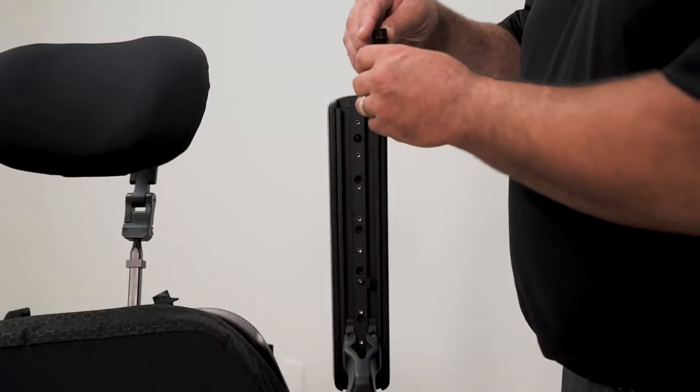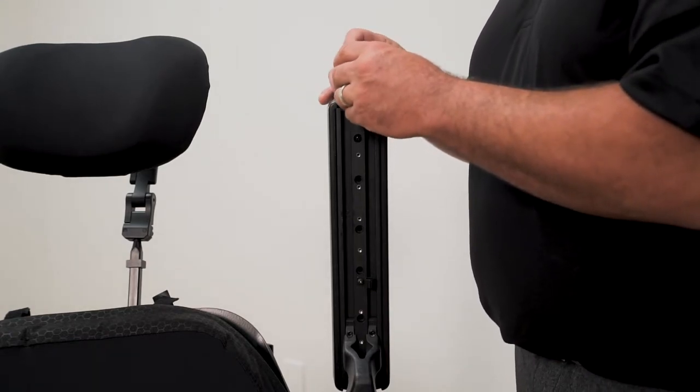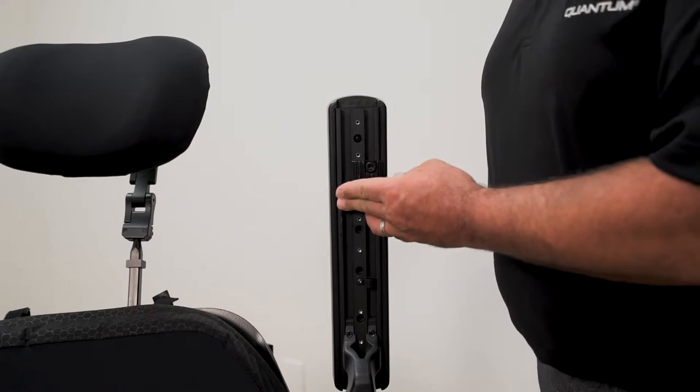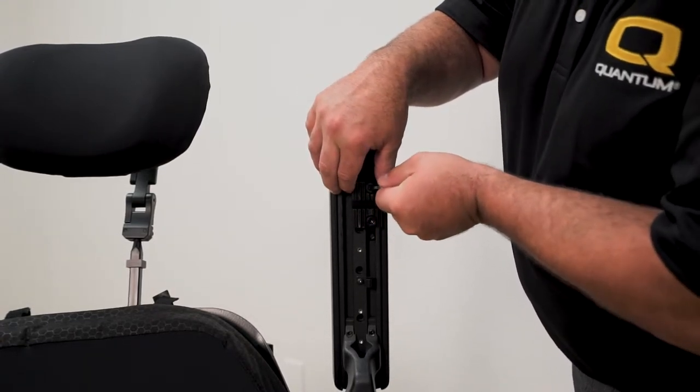To start, grab the display gooseneck clamp and slide the T-nuts into the slots underneath the armrest. For this example, I will be using the outside slot of the left arm. Use a 5 millimeter hex key to tighten the bolts on the clamp to set your location.